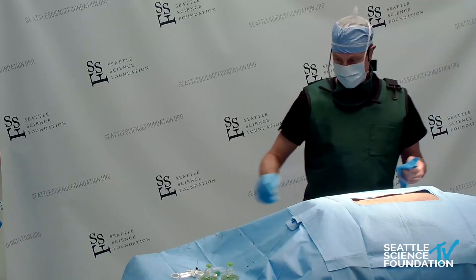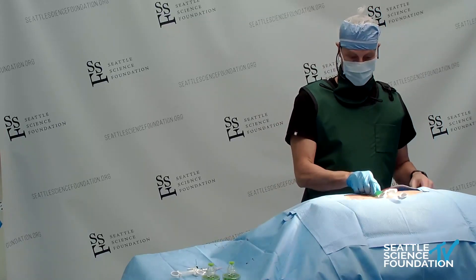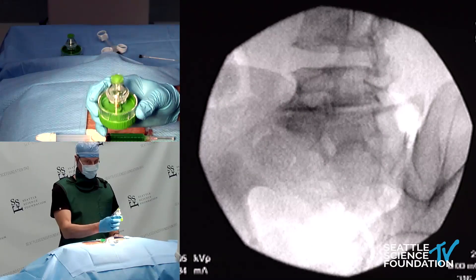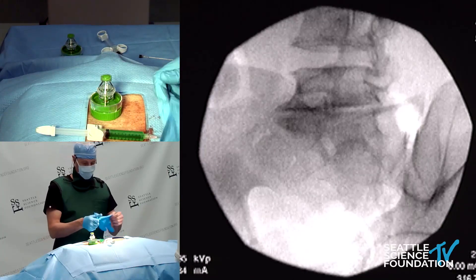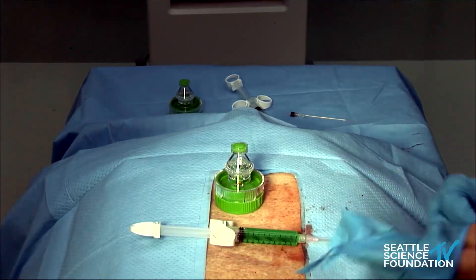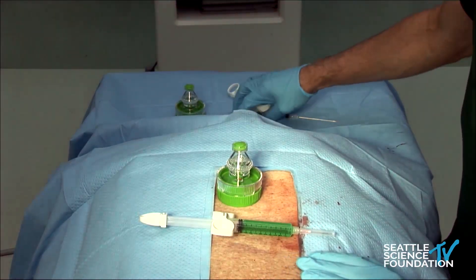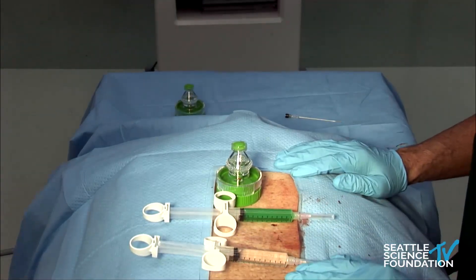Today we are going to demonstrate intradiscal biologics. We have a mixing device from Vivex that makes the ViaDisc. The ViaDisc is a mixture of cellular liquid — about a cc — with micronized disc material, and it is placed in an intervertebral disc to augment the tissue that is lost with degenerative disc disease producing discogenic back pain.